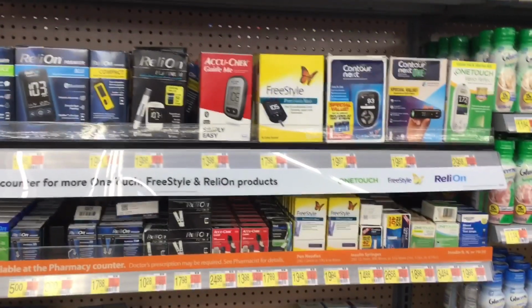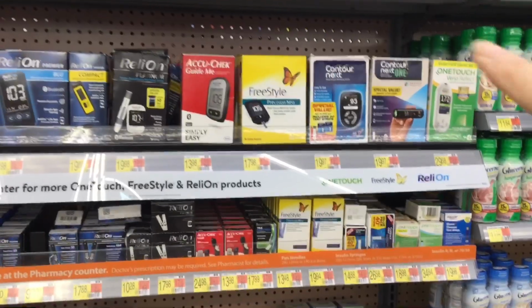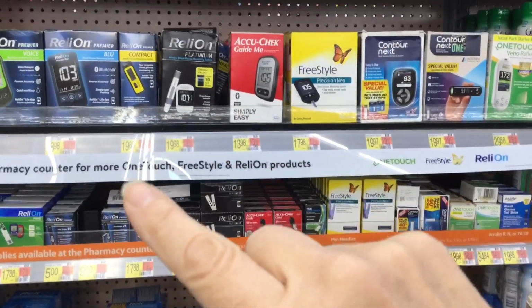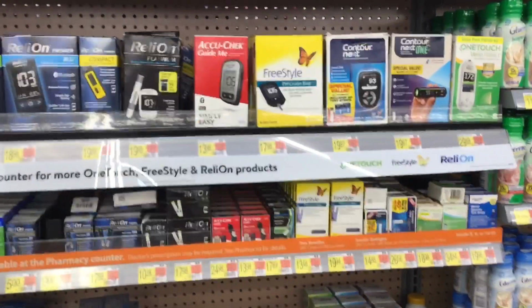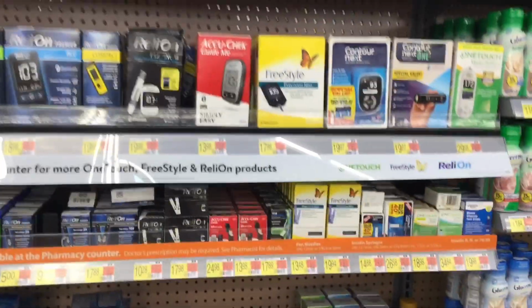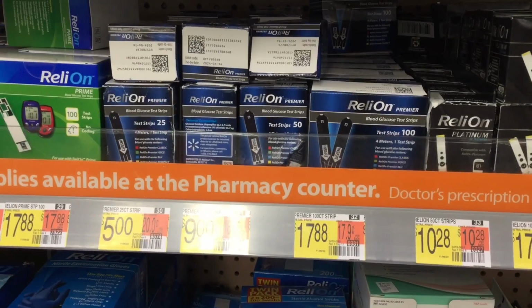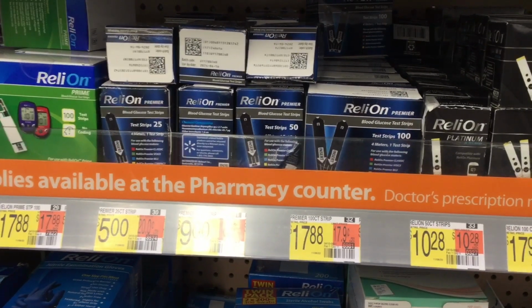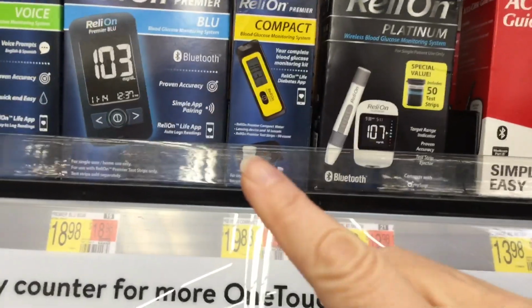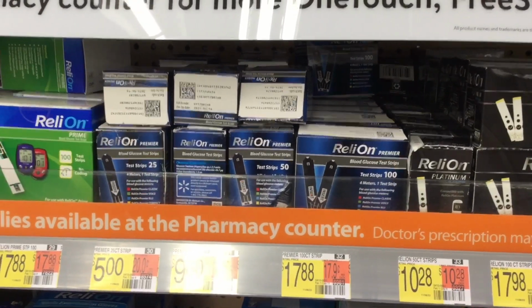Each kit has its own test strips that you would have to buy, and that's where the expense is in testing strips. So even though the Contour Next One is about 20 bucks and the ReliOn Compact is about 20 bucks, the price difference is in the testing strips. I'll show you the price difference. Each brand of blood glucose meter has its own test strips that you put in it. So after you run out of the first 50 test strips that are in that bottle right there, the next thing you end up doing is buying more test strips for yourself.